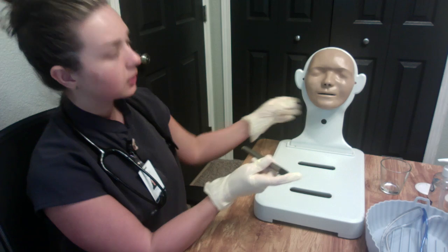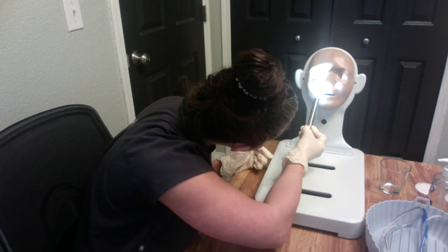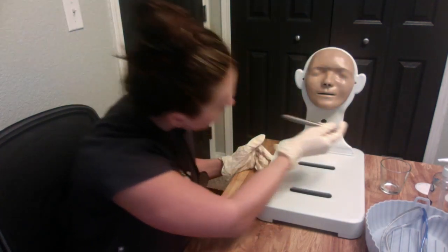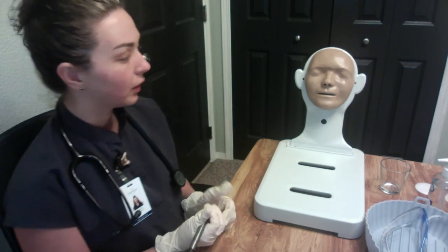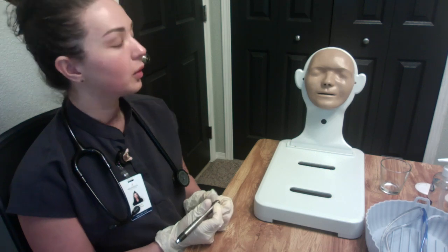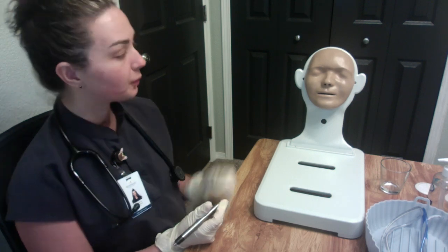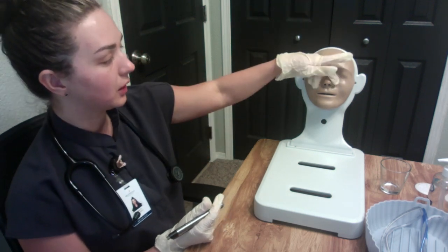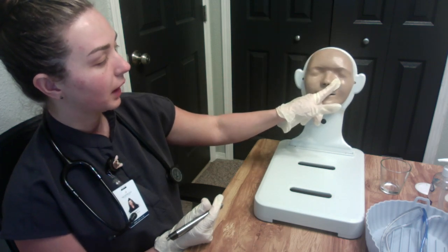While we do this, we would have them hyperextend their neck and we would look in their nostrils. Okay, so after assessment, the nostrils are patent. There's no inflammation, no ulcers, no sores, or any contraindications. So next, we want to see which nostril has the most airflow.